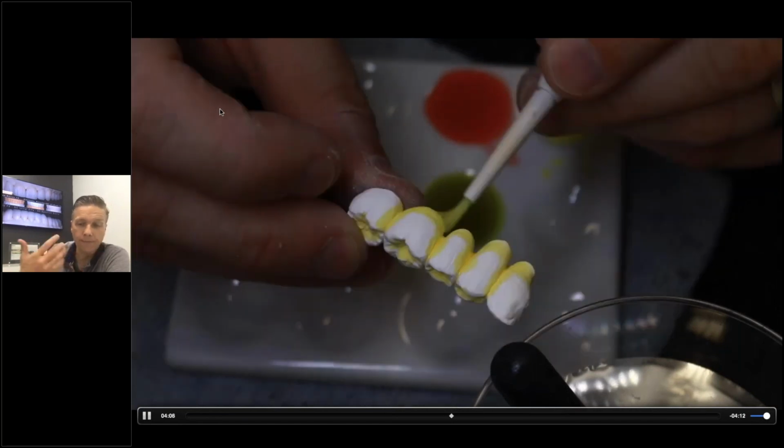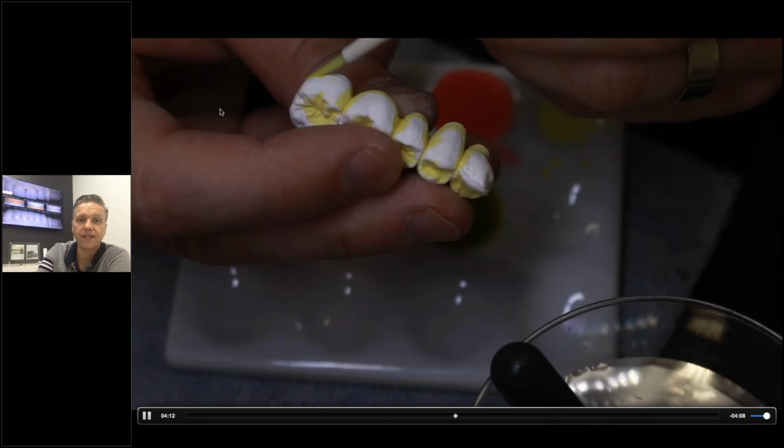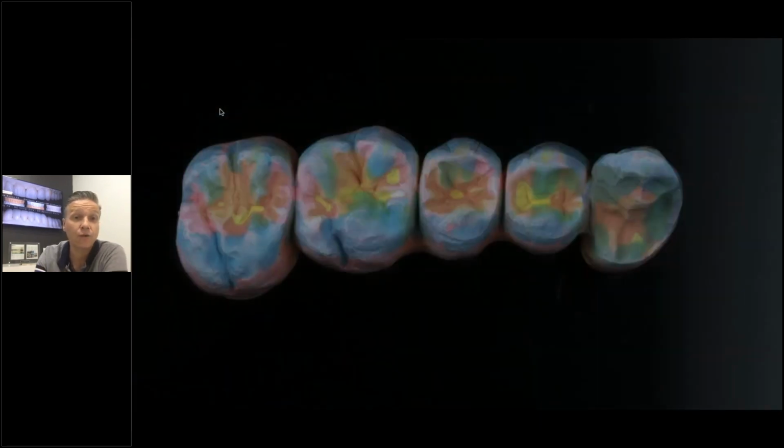Because time-wise I have to move forward, I will just move forward from here. We'll show you the final staining, or the final coloring. Basically, it's very colorful. The blues and greens are incisal colors, enamels basically. The red and yellow are more the dentin colors I'm utilizing here.